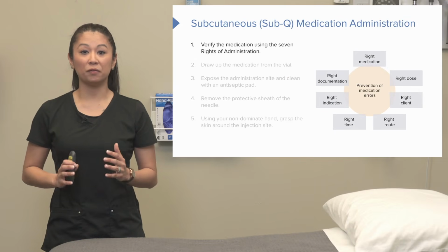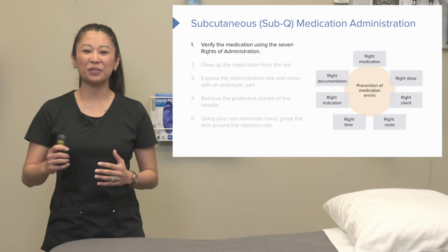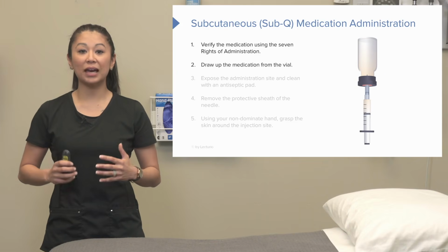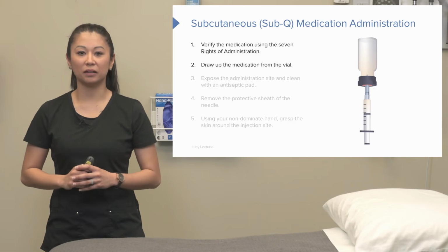Don't forget to verify your medication using the 7 rights of medication administration. And next, we're going to take a look at drawing up the medication from the vial.